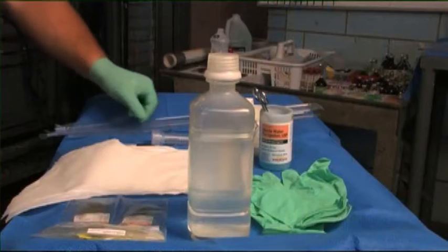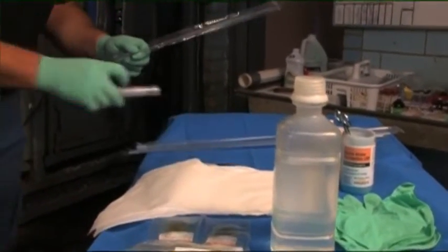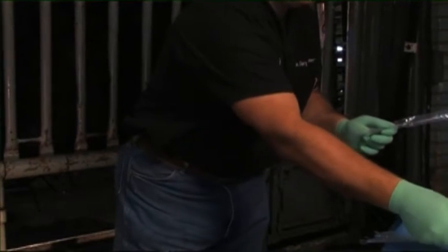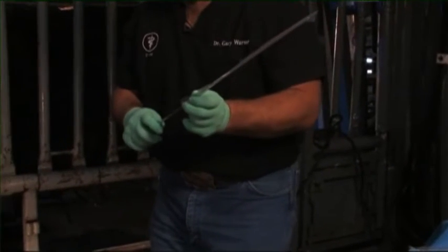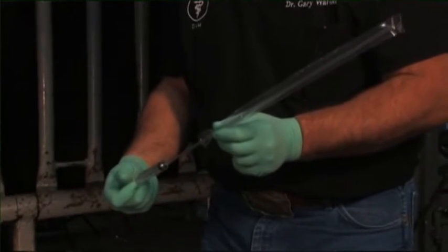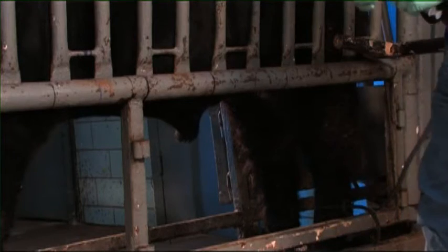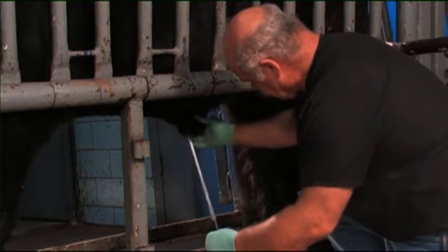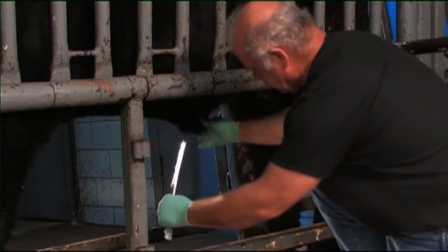Now we'll prepare for sample collection from the bull, using a new 12 cc syringe to produce a vacuum on our guarded pipette that will reduce any contamination as we go into the sheath. And now we're prepared to collect our sample, introducing our pipette into the sheath.